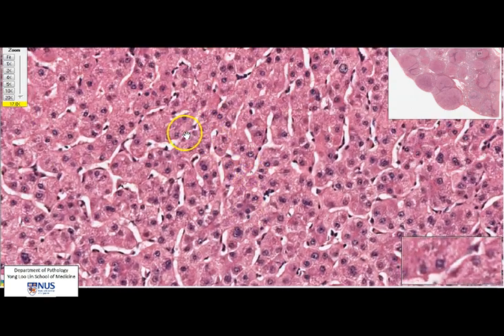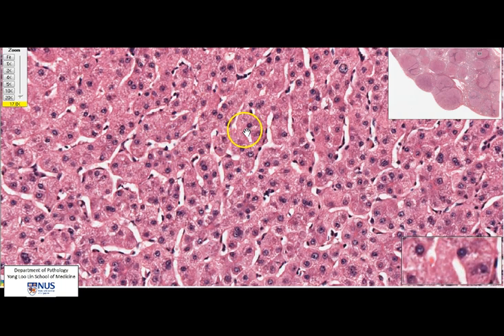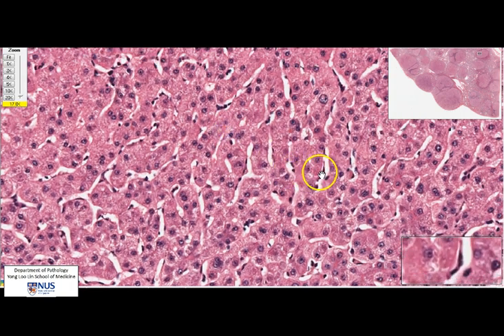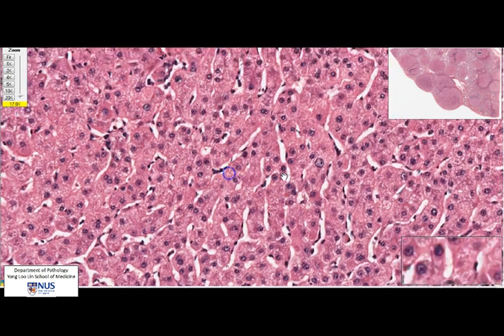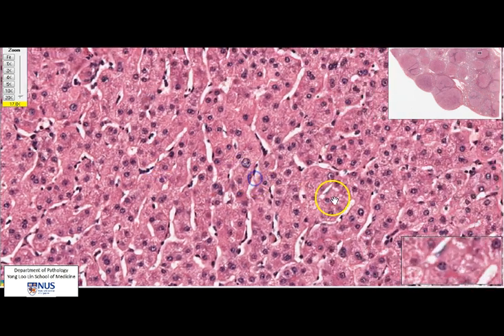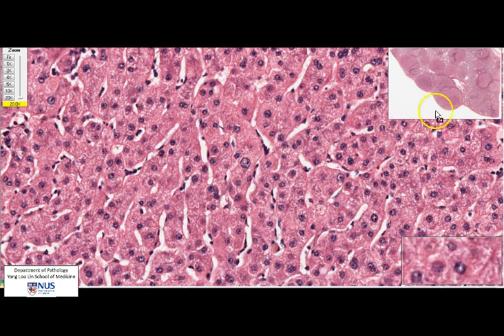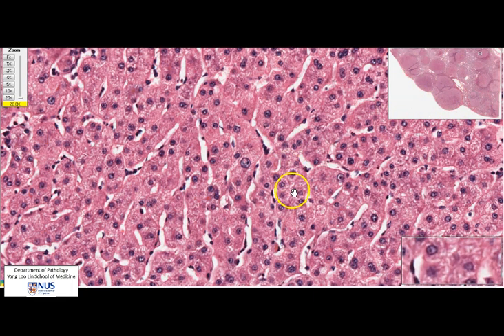These would be the sinusoids, and these are the hepatocytes. Some of these cells would be Kupffer cells, which are macrophages. The hepatocytes themselves don't look too abnormal, so this is more something that we appreciate on low power rather than at high power view.